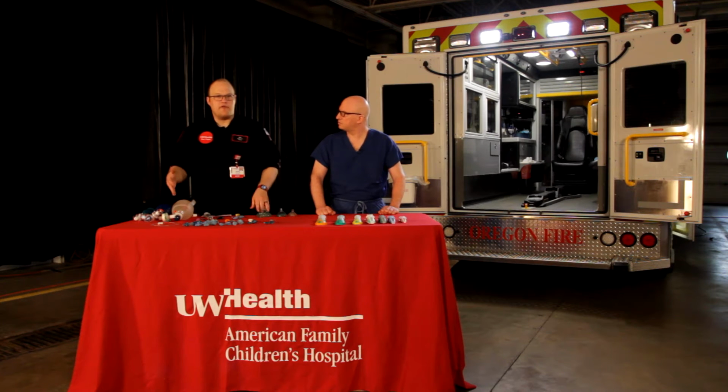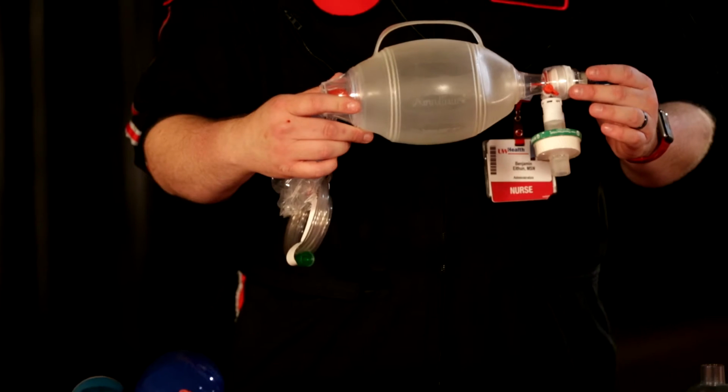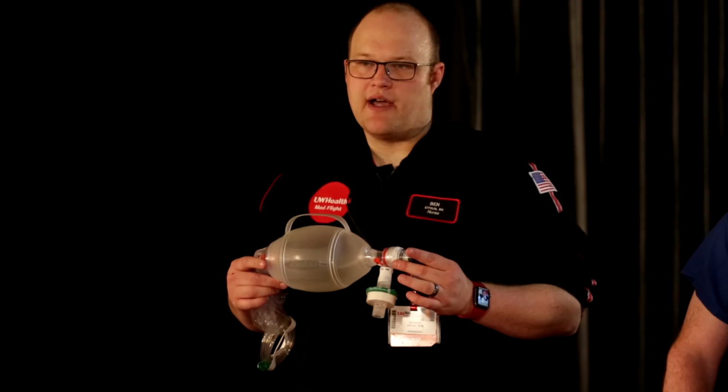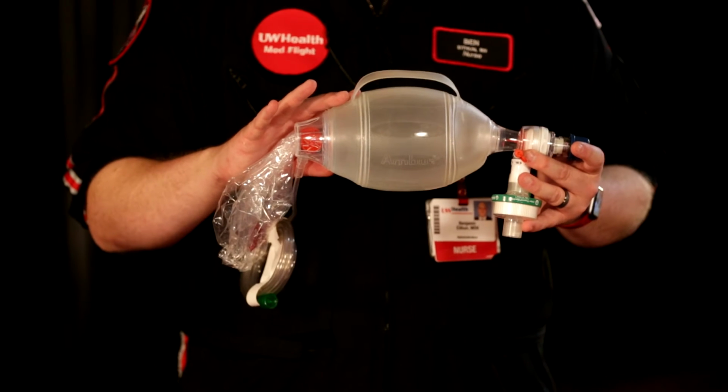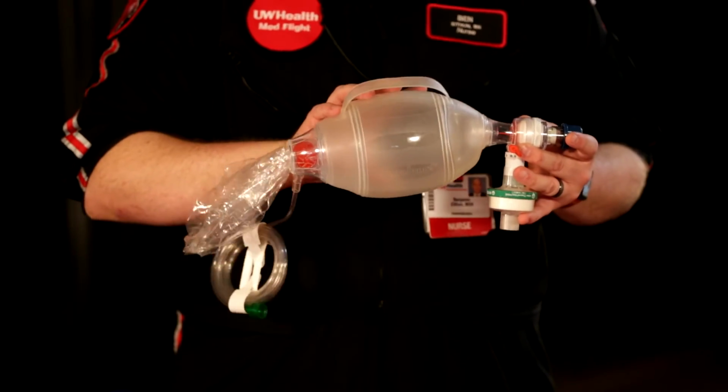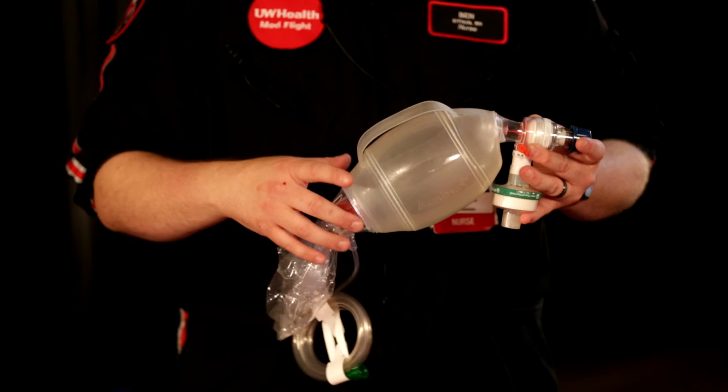Then you want to actually make sure you have a bag that works as well. So again, size range. This is kind of a standard adult size bag. They do come a little bit larger and they certainly come smaller, but whatever bags you use, you want to know how they work. For example, if this one is a self-inflating bag, it doesn't need to be hooked up to oxygen, but it does have the ability to. So if you do want to give supplemental oxygen, you can, but it doesn't require flow, as opposed to more like a Mapleson bag that would.